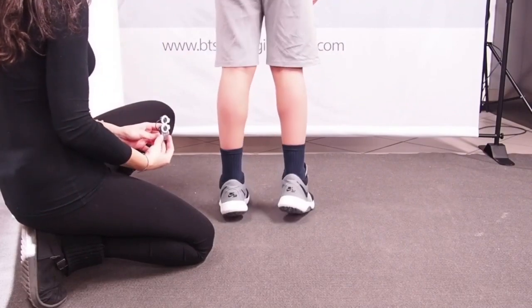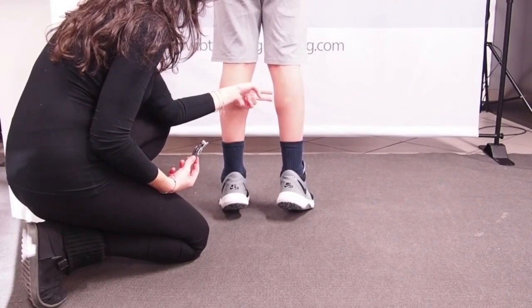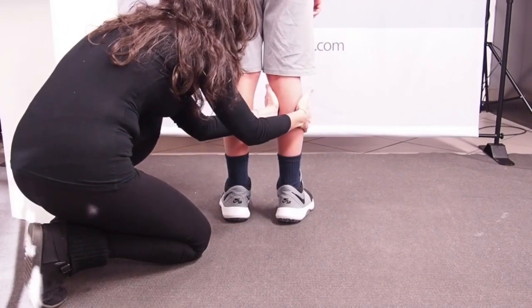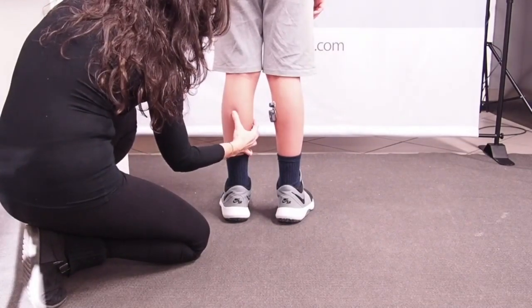For the positioning of the electrodes on the medial gastrocnemius muscle, we ask the patient to go on the toes and place the electrodes exactly on the belly of the muscle in medial position. We repeat the same process also on the left.